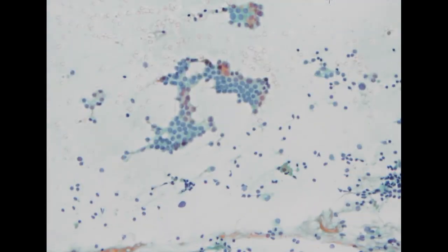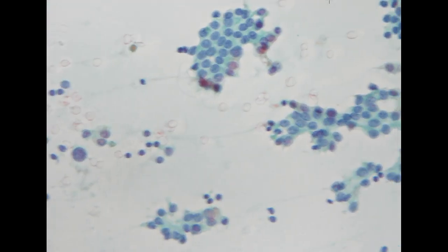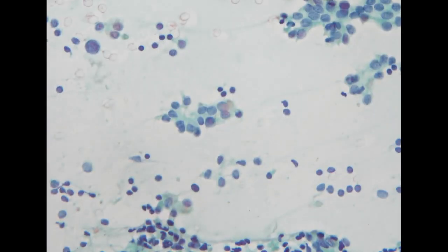And when you go to higher power, you can appreciate these powdering chromatin pattern, and these like elongation of the nucleus, enlargement. So these looks like a PTC.